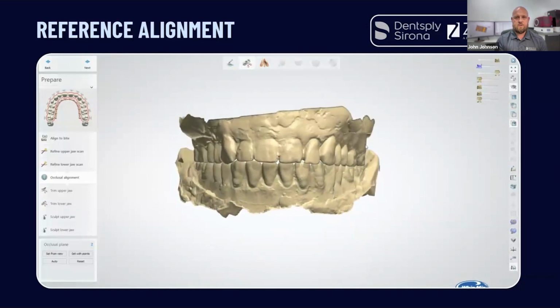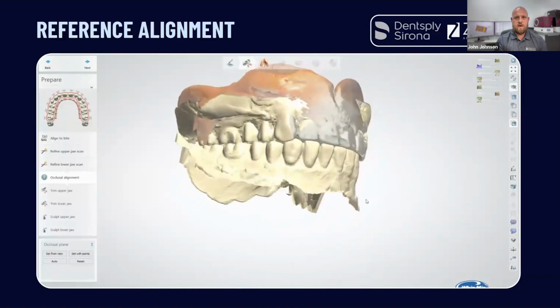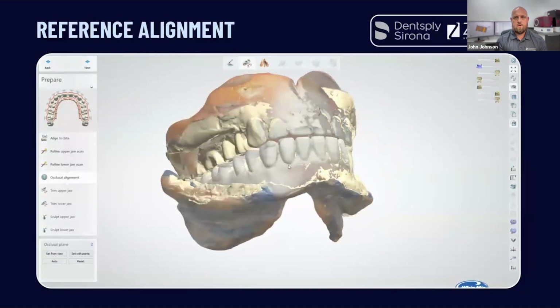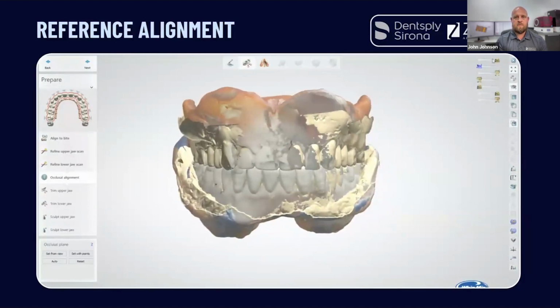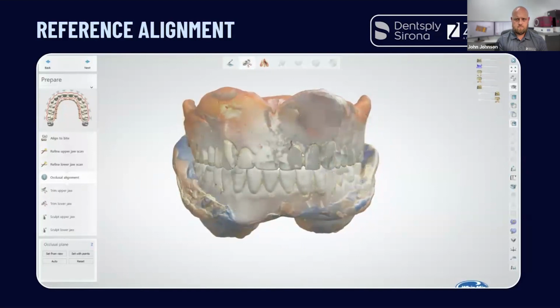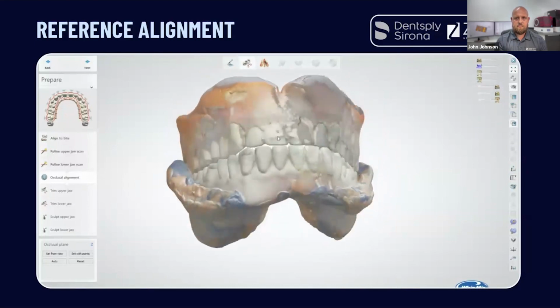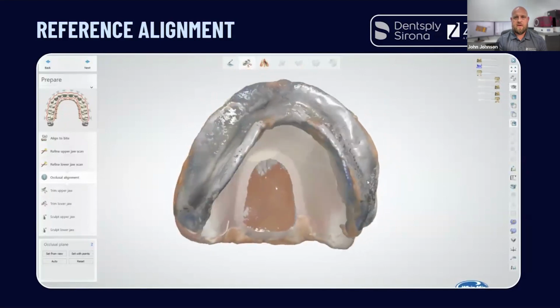So now there's her scan that they did in the office. Here's the alignment of the upper denture. So we align that. And there's our lower. And now we've got the outer surface aligned. Now all we have to do is align the inner surface, which is the intaglio. So we have aligned the upper intaglio, and you see how it's kind of dappled. That really shows you that you've ensured that alignment.